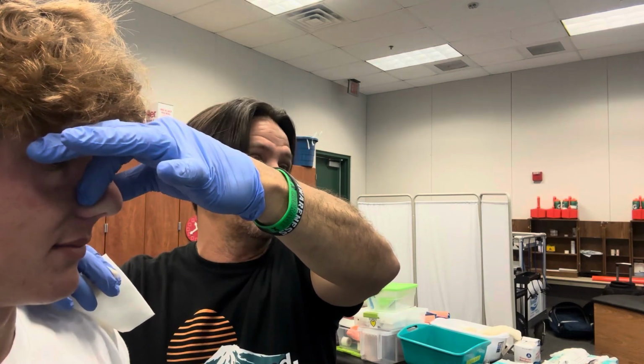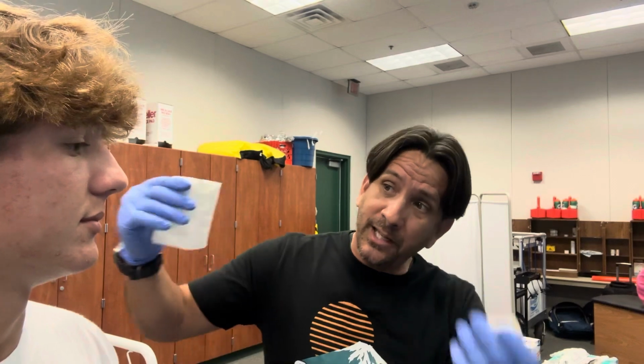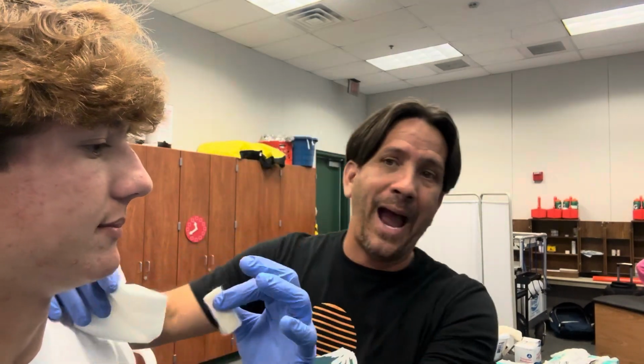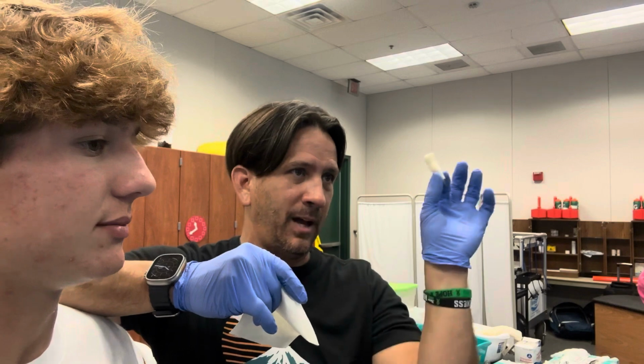You'll pinch both sides of his nose so that he can't breathe out of his nose and the blood can't continue to trickle down or even run down both nostrils. It's usually one nostril that is bleeding, usually not both. So first thing, I'll look under his nose and find out which nostril he is bleeding from. I'll pack the nostril with the BleedCease. We'll pack it so much that you can barely see the end of the supply.